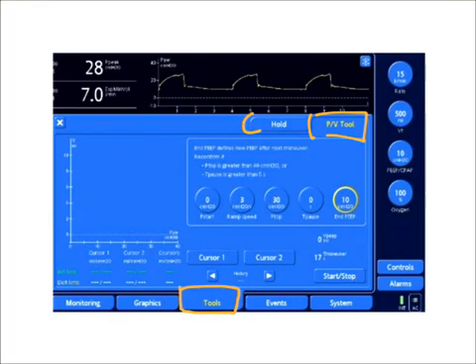So the tool is similar to the Avetus tool, where it allows you to evaluate the inspiratory-expiratory limb for both your lower inflection point, upper inflection point. So this just demonstrates you can set your P-high initially based on your pressure volume curve.